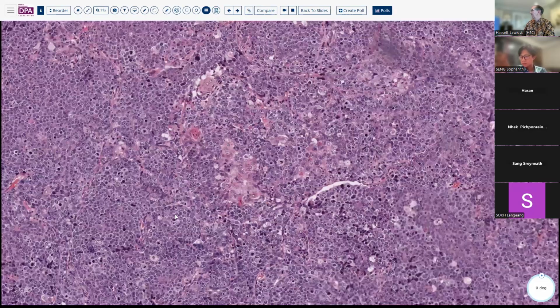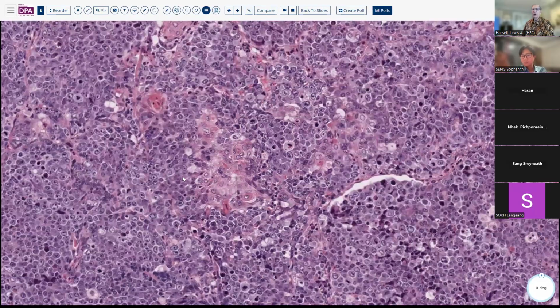as we've indicated here. So NUT carcinoma, this is not a tumor that is very common, but it's certainly one to be aware of because treatment's going to be quite different than if you're thinking lymphoma or other undifferentiated malignant tumors in this case.